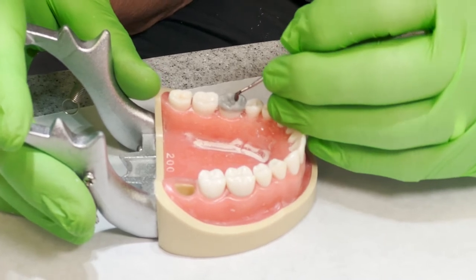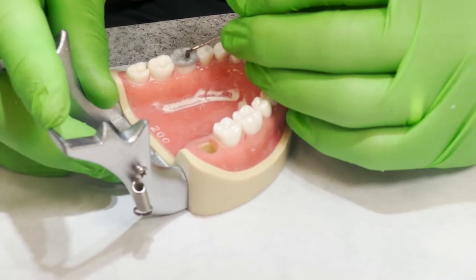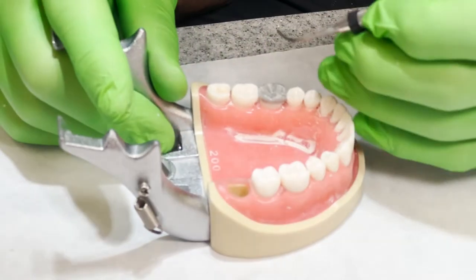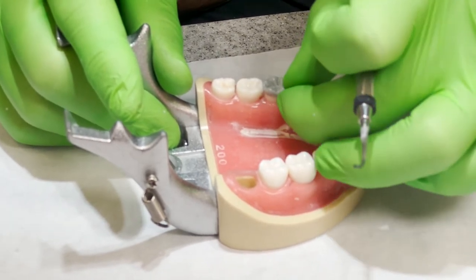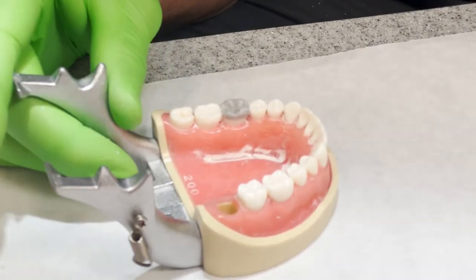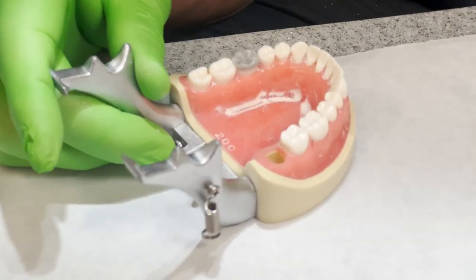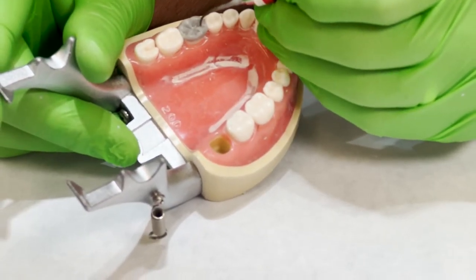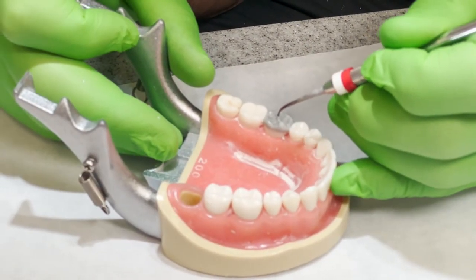A word of caution, everyone. If you have long hair, it's a good idea to put on what my daughters call a piggy, or something to hold your hair back so that it doesn't droop into the flame. Please be very careful with that. The same is true if you're back in the lab and you're using the lathe. Always, always have your hair pulled back so that it doesn't get caught in the burr of the lathe. Good suggestions.